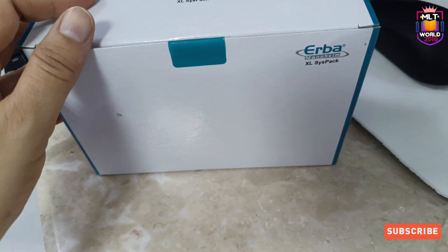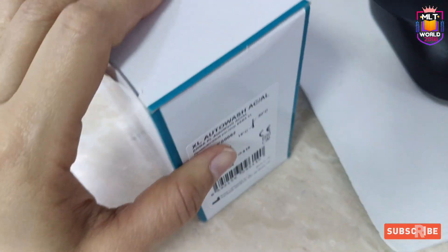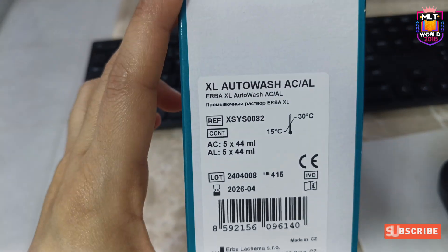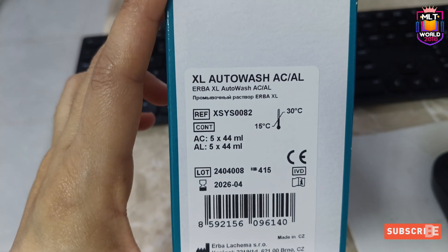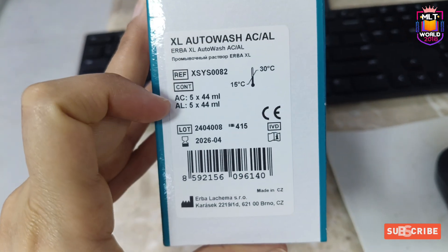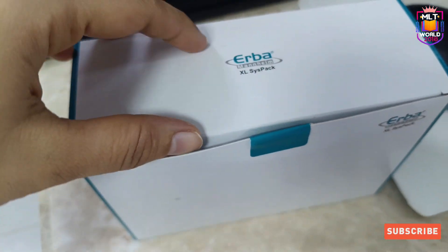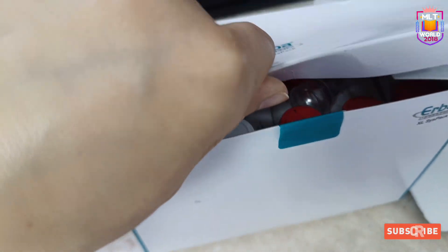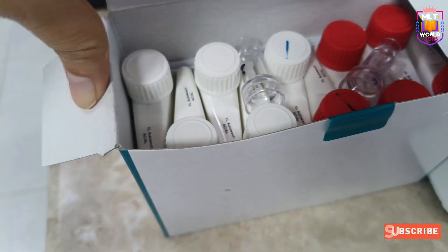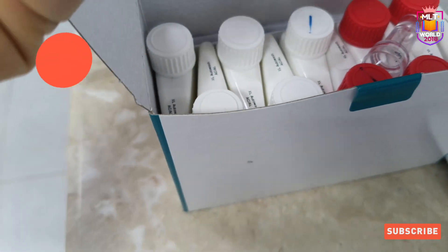These options are all available in the maintenance section of the machine. To perform auto wash maintenance we need XL auto wash AC and AL reagent. That kit is stored at room temperature, and there are two reagents: AC and AL.